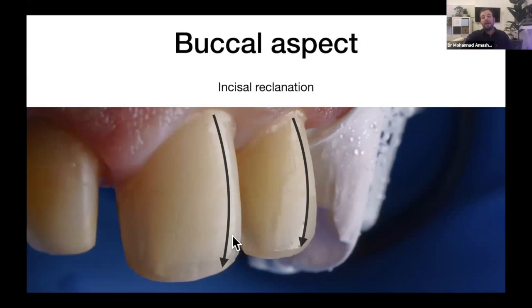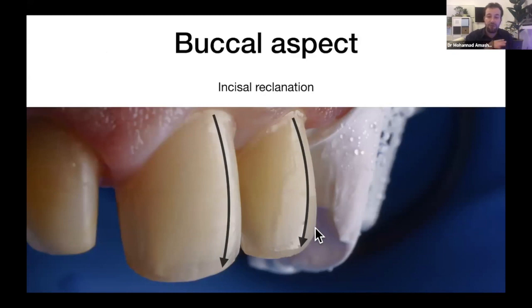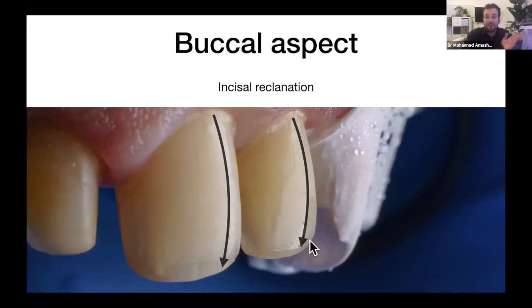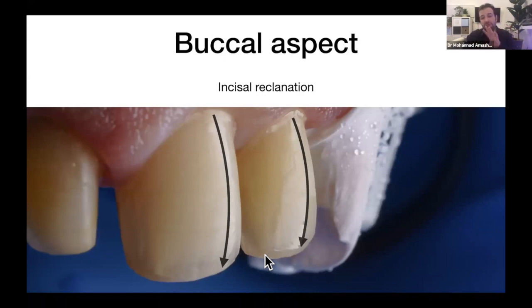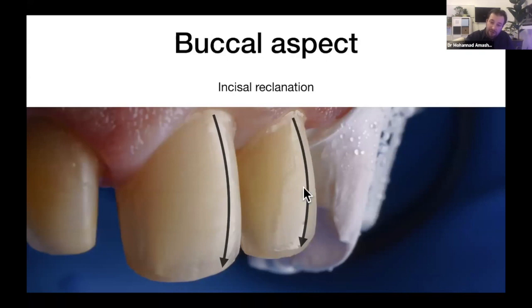For the buccal aspects, always make sure you have incisal reclination. I see a lot of dentists prepare well in the main buccal area but forget to give the lab technician space at the incisal region. If the preparation is one flat plane, the lab has no space to build up that area where he needs to place the opalescence effect and build the incisal edge character. Give your lab technician two planes of preparation — the first plane on the main buccal surface, and the second plane at the incisal — and you can round the transition between them.